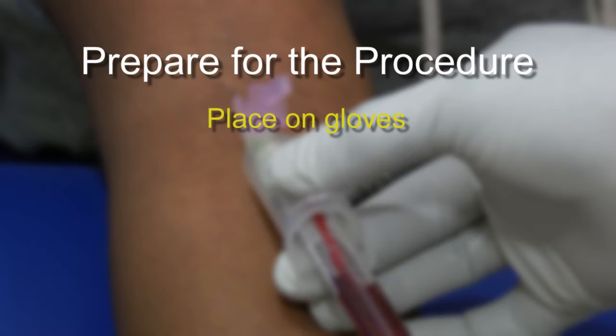Place on gloves. You can place on gloves prior to the procedure. However, it can make palpating a vein a little more difficult.